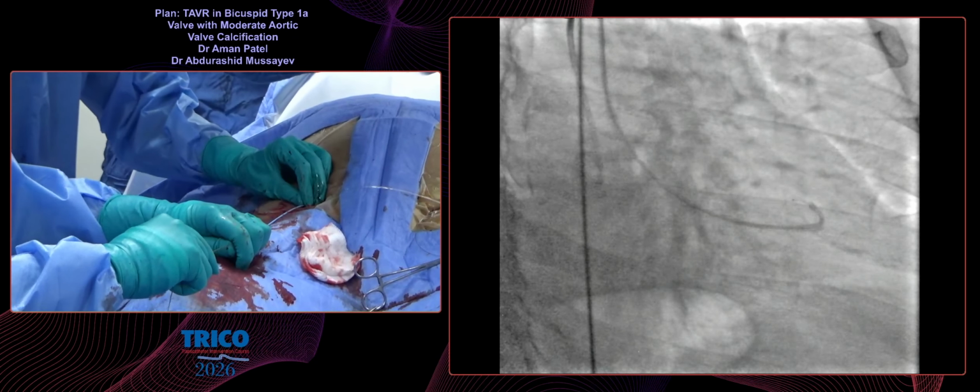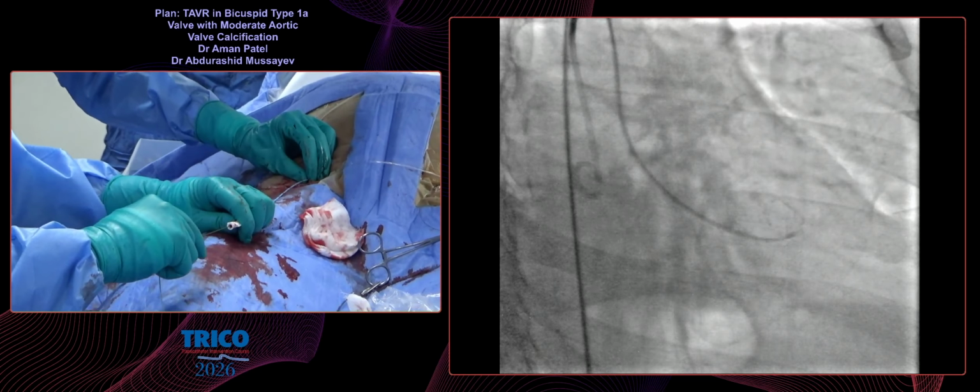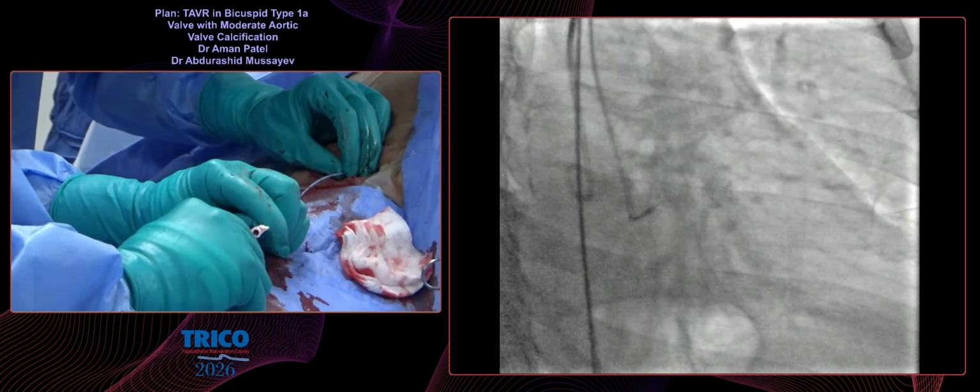And the second question is, do you have echo in the room? Yes, we have a mandatory transthoracic echo provision. Okay. We are not having a transesophageal this time. Okay, thank you.